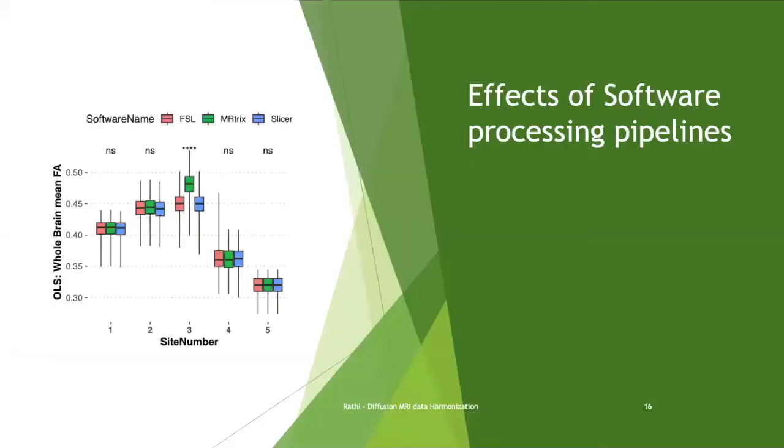So here is an example of what we recently did. What we see here is the effect of software processing pipeline on a set of data sets.